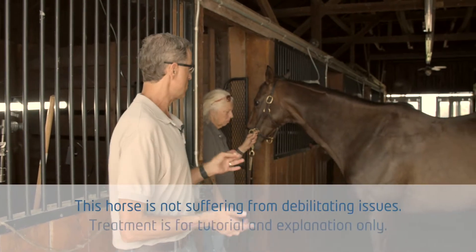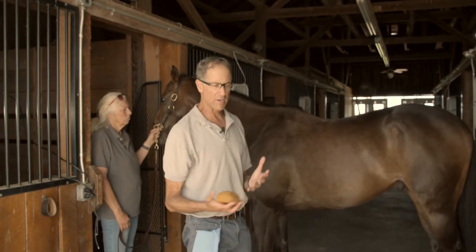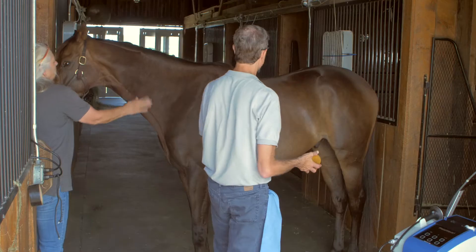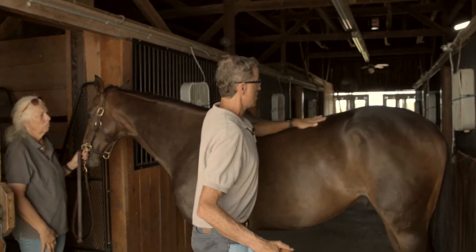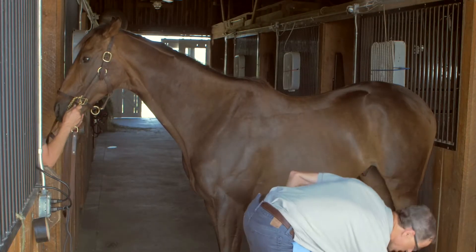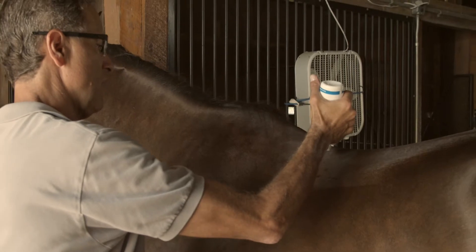The first thing I'm going to do is demonstrate how I prepare a routine treatment for a horse with a sore back. The whole thing about the efficacy of delivering this energy is a coupling of the therapy source to the tissue. So I moisten the area and then I follow with a generous delivery of gel.